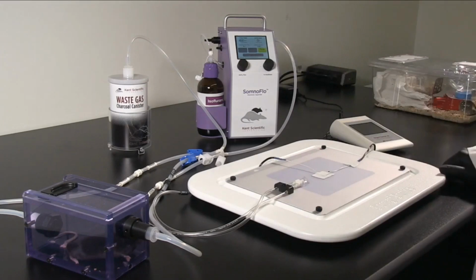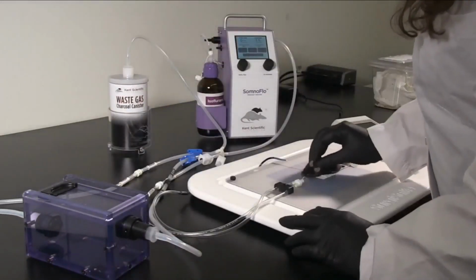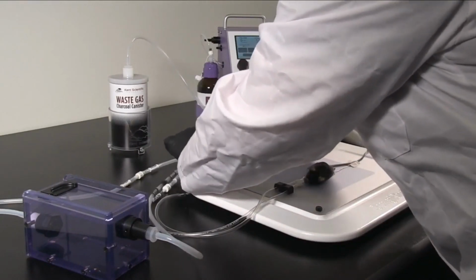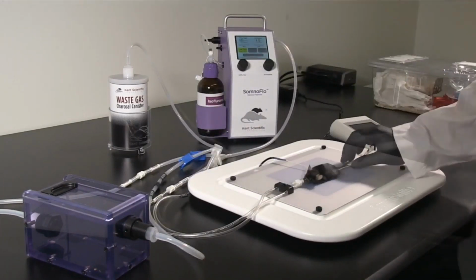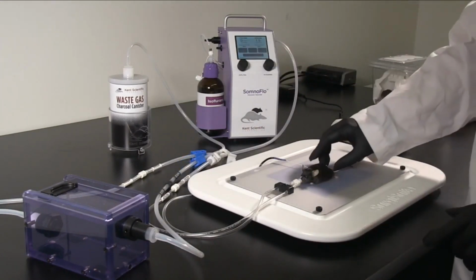If desired, purge the chamber using the purge feature. Remove the animal from the chamber and position on the nose cone. Be sure to adjust the clips to direct the airflow to the nose cone. Touch low flow to resume anesthetic delivery. When you're finished with the procedure, touch low flow again to stop delivery and recover the animal.